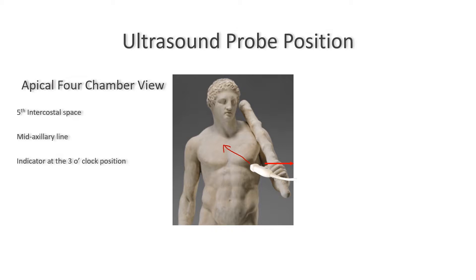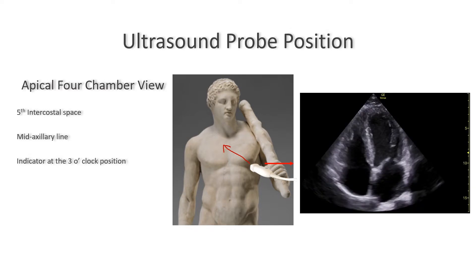You should be getting an image looking like this. Note that the left ventricle should be about two-thirds and the left atrium should be about one-third of the entire longitudinal axis of the heart. The apex should be elliptoid in shape, and if the left ventricle is foreshortened, the apex will appear a little bit more rounded. To optimize your image, you may have to reposition the patient in the left lateral decubitus position.